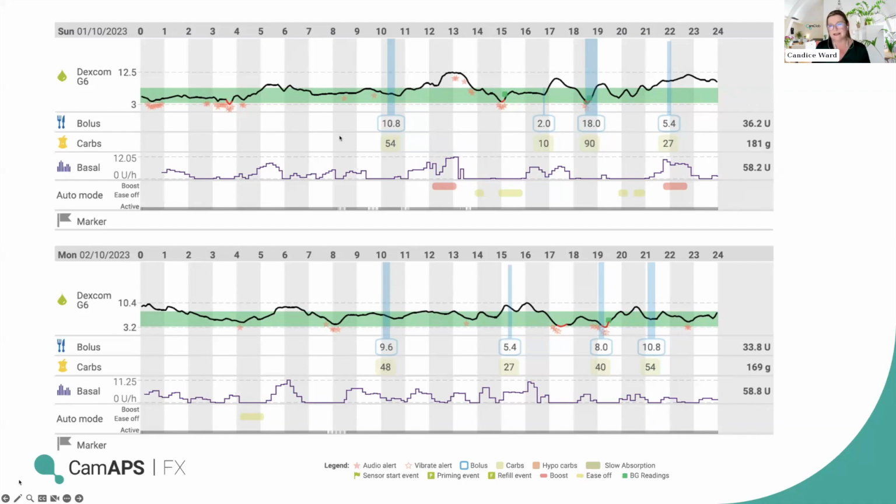And then obviously, as you well know, type 1 diabetes is not only about the insulin. It's a hard condition to manage. It comes in the widest circumference of who they are. Are they working? Are they busy? What is the best treatment for them? And it may be not sticking to the 5 throughout the day for her and putting it slightly higher to compromise, so she can gain a little bit more trust in this system.